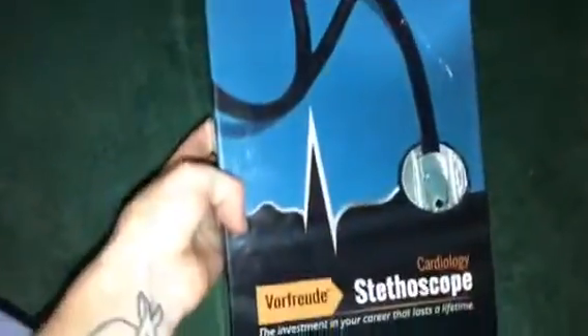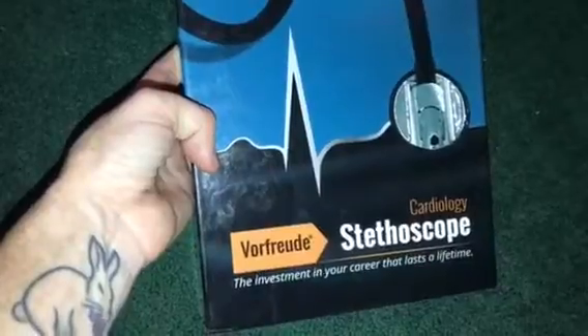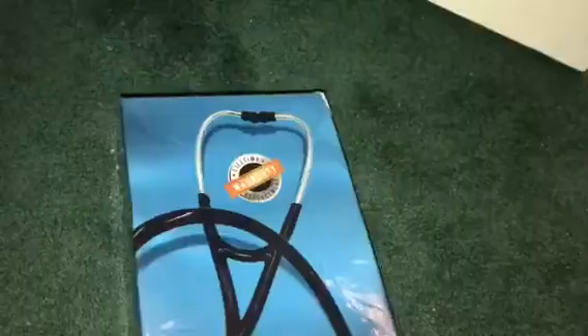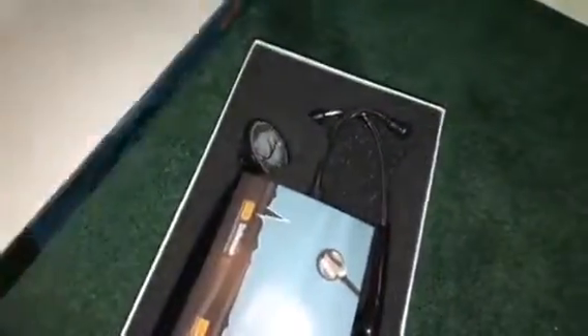Hey guys, today I'm reviewing the cardiology stethoscope. This is what it looks like — it has a lifetime warranty replacement on it. I'll go ahead and open the box for you to show you what it looks like.